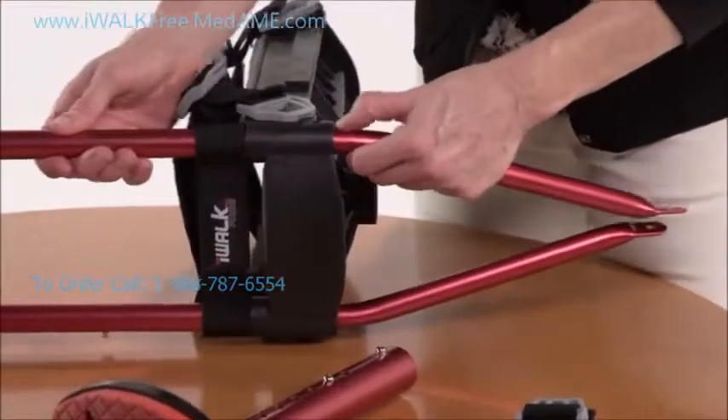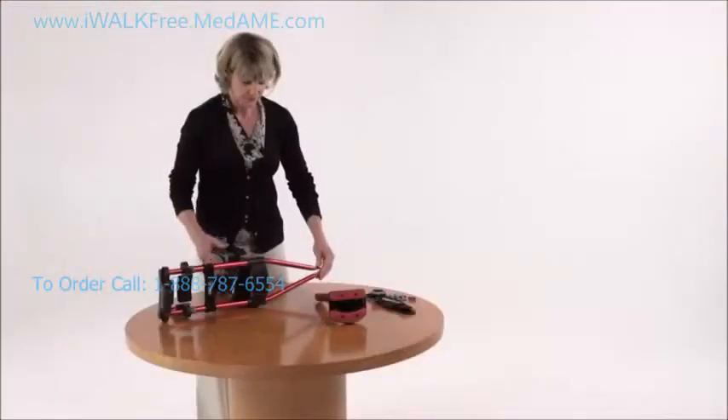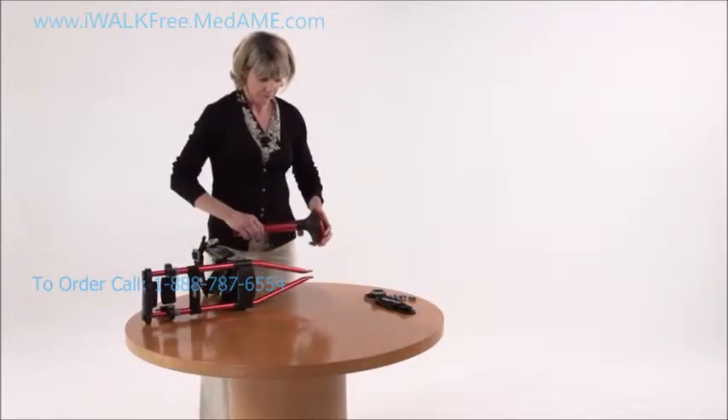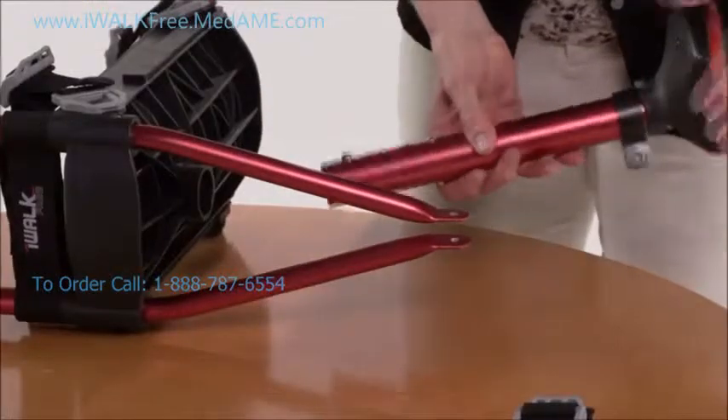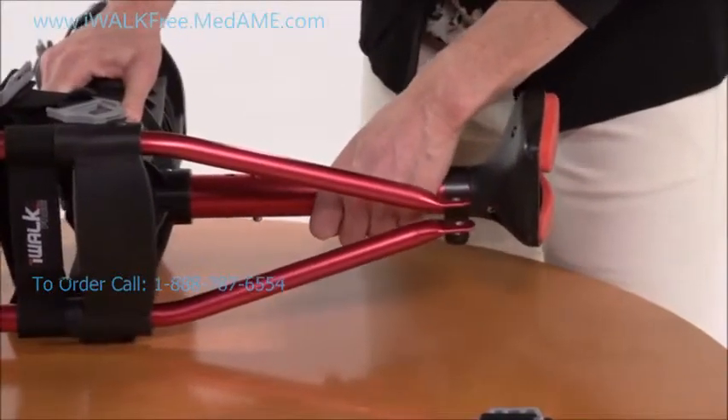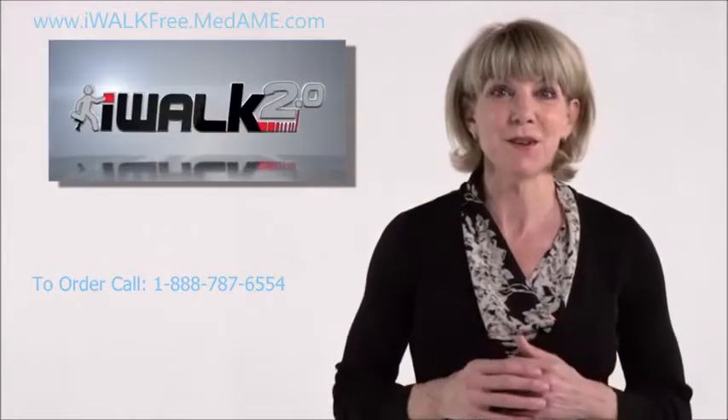Now we put the lower assembly into the large socket on the underside of the knee platform. It snaps in the same way — just push the spring heads and insert the tube into the socket. Test it by pulling on it to make sure it won't disengage.